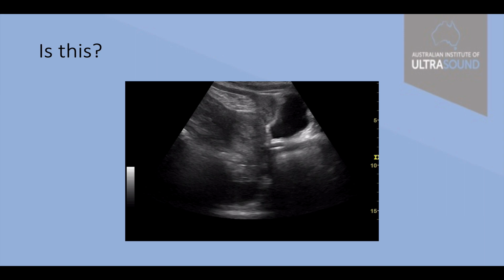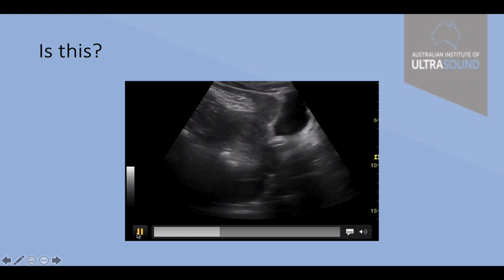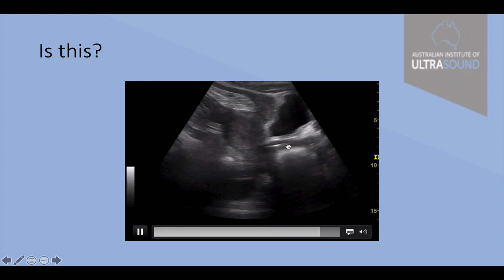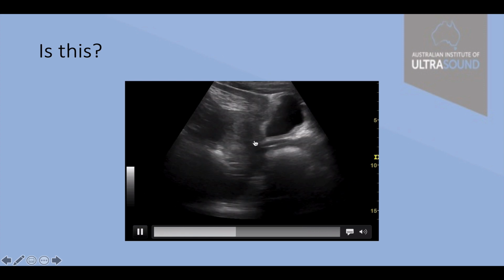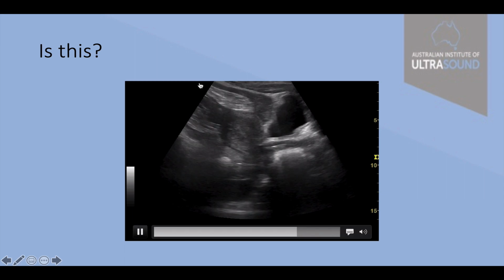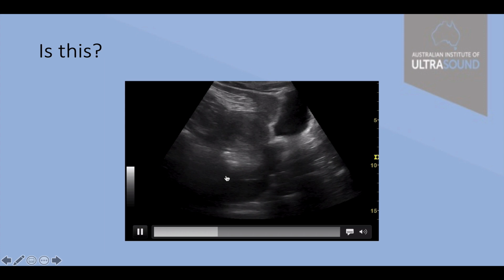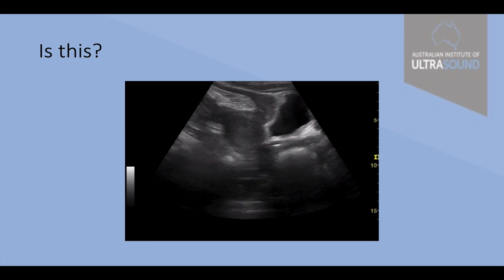Even more so in this case, this is another suprapubic long view in a young woman. We have the symphysis pubis on the screen right and the bladder underneath it. Underneath the bladder is the vaginal stripe and the rectal gas shadow. This here is the uterus with the cervix, some edge artifact. Isn't it scary, the other masses we have in here? Normally, the back of the uterus is bounded by bowel gas, but instead, this time, we can see right down deep here to what looks like a dark collection of some sort.